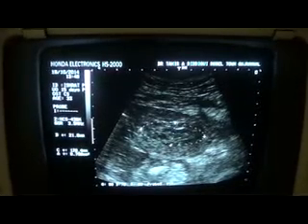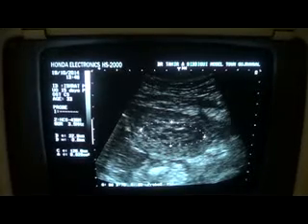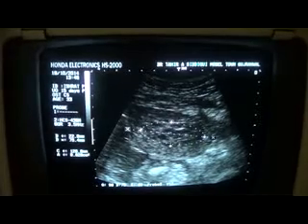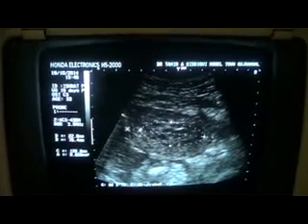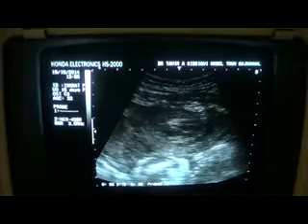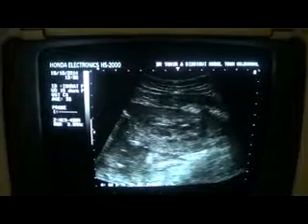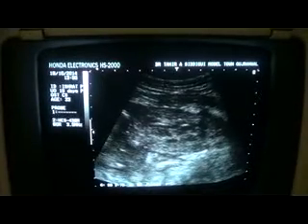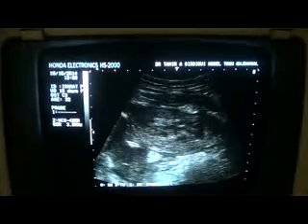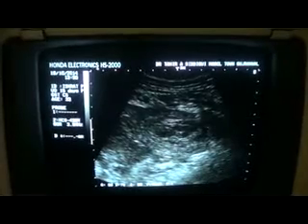This is the endometrial canal, and this is the uterus, in transverse section. We can see that in the endometrial canal there are multiple echogenic particles with fluid within it, and a few of them are giving shadowing as well. This is a tiny particle giving shadow.